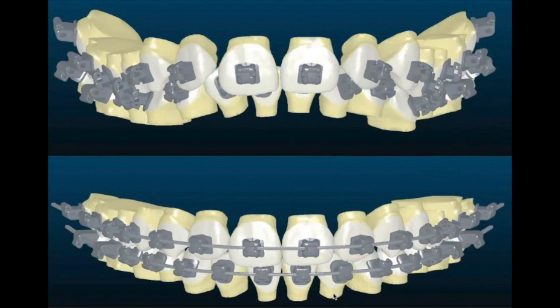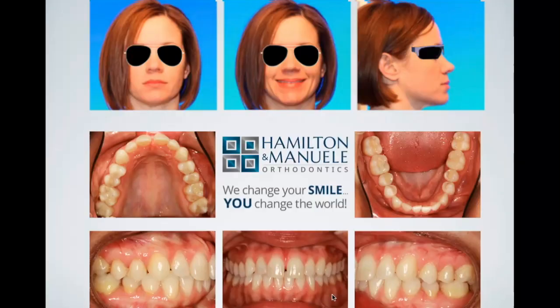Yeah, that's a good point. Any of the final in and outs that were needed that couldn't be attained by the bracket alone, they would put in the wires, and they would have a custom arch form as well. So instead of having a stock, rounded arch form, the arch form would actually be customized depending on the patient's anatomy and whatnot. So yeah, kind of a cool concept.